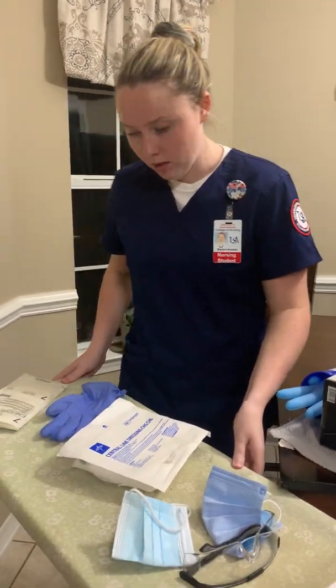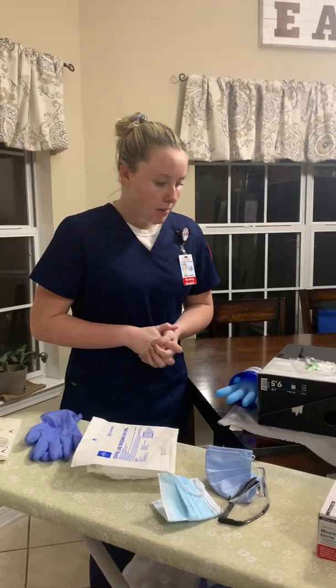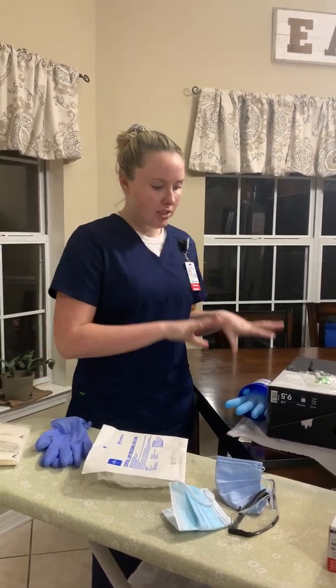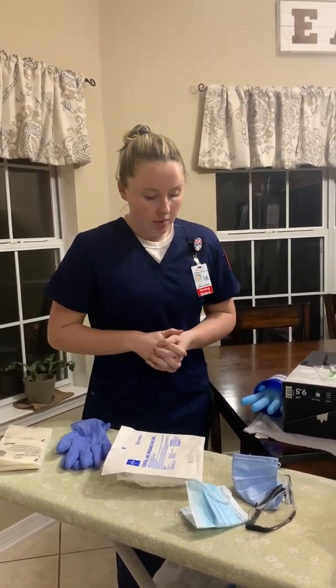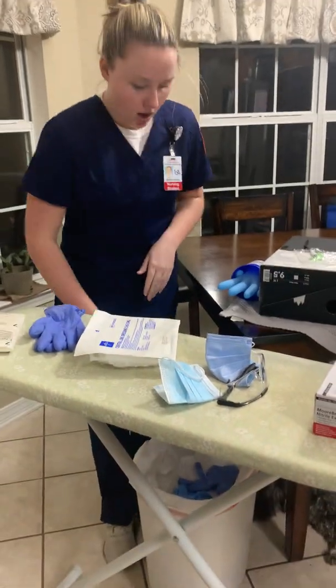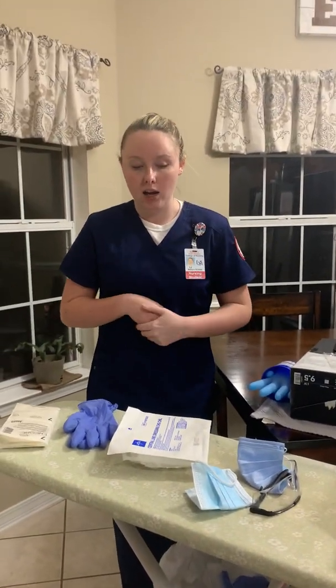And after I've done that, I'm going to move my bedside table, my simulated bedside table, close to my patient. That way I have materials real close. And usually I would get something at waist height, because when I become sterile, I can't go below my waist, and I would just keep that in mind in real life. But this is what we have for today. And I'm going to move my trash can. And after I move my trash can, I'll perform hand hygiene.